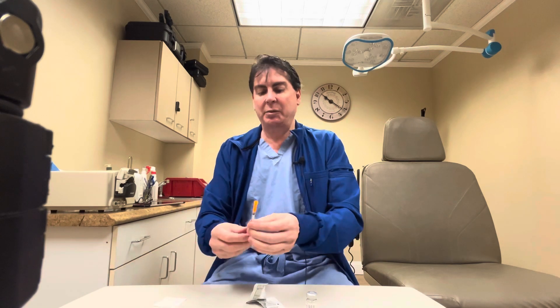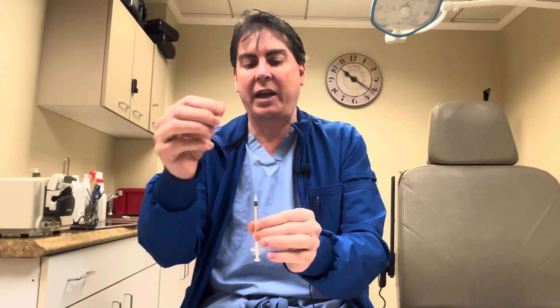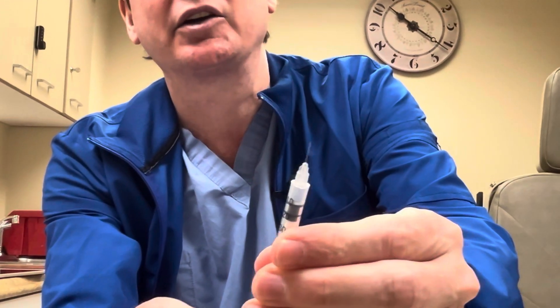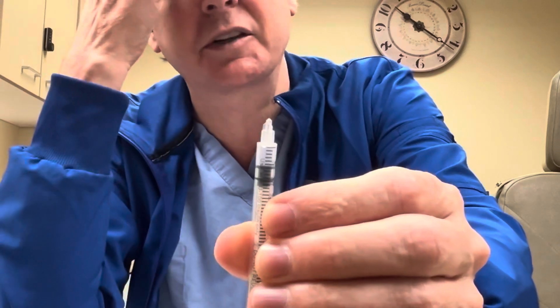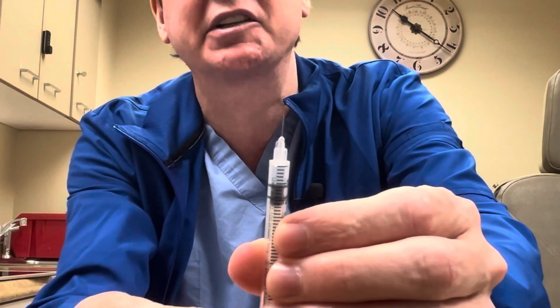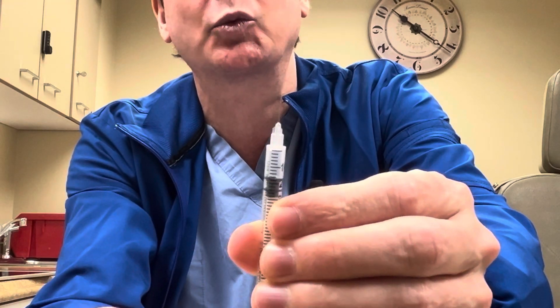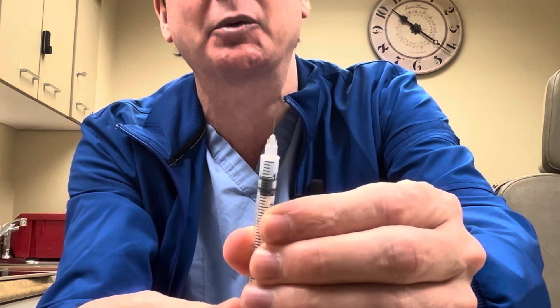Step two: take the two orange caps off to expose the needle. You will withdraw to the ten-unit mark, which is only ten percent, for your first week or two of injections. The black rubber hub is where it's going to be from there on up.